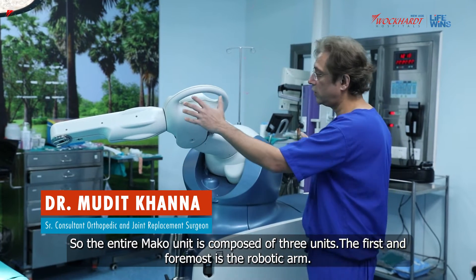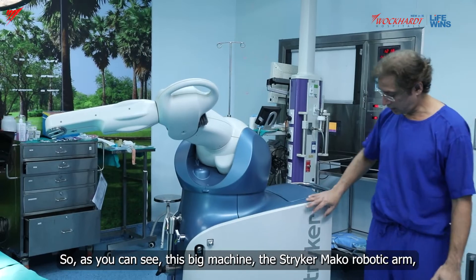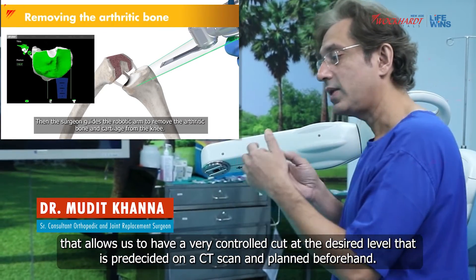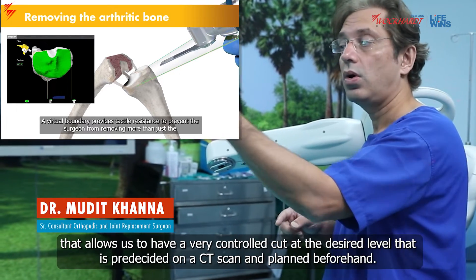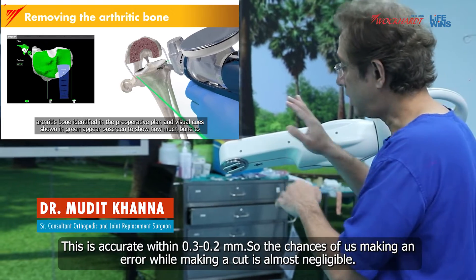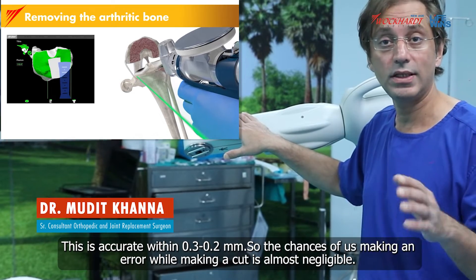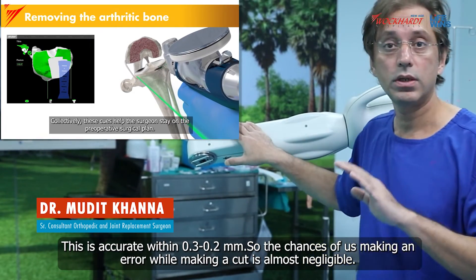The first and foremost is the robotic arm. As you can see, this big machine — the Stryker Mako robotic arm — allows us to have a very controlled cut at the desired level that is pre-decided on a CT scan and planned beforehand. This is accurate within 0.2 to 0.3 millimeters, so the chances of us making an error while making a cut is almost negligible.